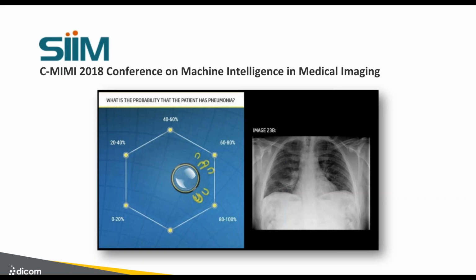We can't really do unsupervised deep learning on medical images. The algorithms really need to be given some very well-educated idea about what they're looking at. And so if you're giving multiple radiologists an opportunity to collaborate on the training of those algorithms, now you're not putting it in the lap of one radiologist who would potentially have a biased opinion of whether or not this patient has pneumonia.